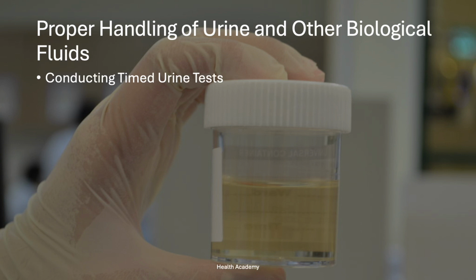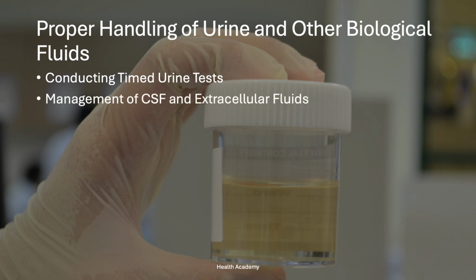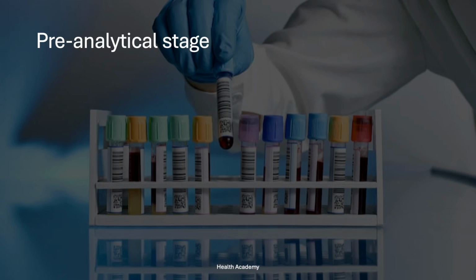Management of CSF and extracellular fluids. Prompt processing of CSF and fluids like ascitic and peritoneal fluid is crucial. They should be gathered in sterile containers and, if not analyzed immediately, stored at 2 to 8 degrees Celsius. It's essential to discard samples that are hemolyzed, insufficient in volume, or improperly collected to prevent analytic complications. Pre-analytical stage. The pre-analytical phase of biochemical testing is susceptible to errors, mainly from human handling. It's essential to strictly follow the established procedures to ensure quality standards are met. Let's explore this topic further.